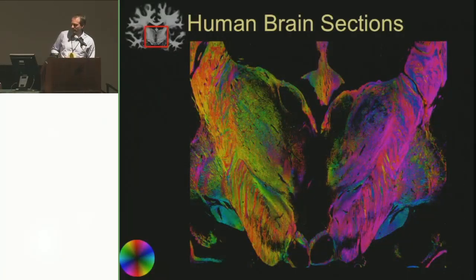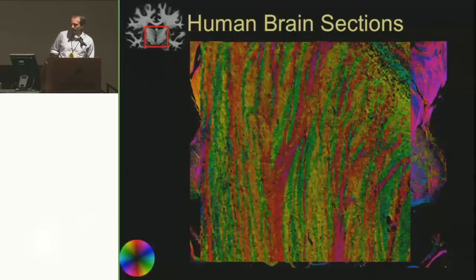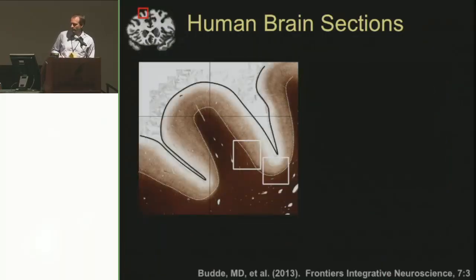Here again, even looking at some of the deeper brain structures, the cerebral peduncles at the bottom, as well as the internal capsule here, you can appreciate just the amount of structure, even though we consider this a normal coherent pathway. There's really a lot of microscopic detail here that we can piece out. So again, it speaks to that even if we think we're looking at a single fiber bundle, sometimes there's a lot more structure going on that we don't appreciate.